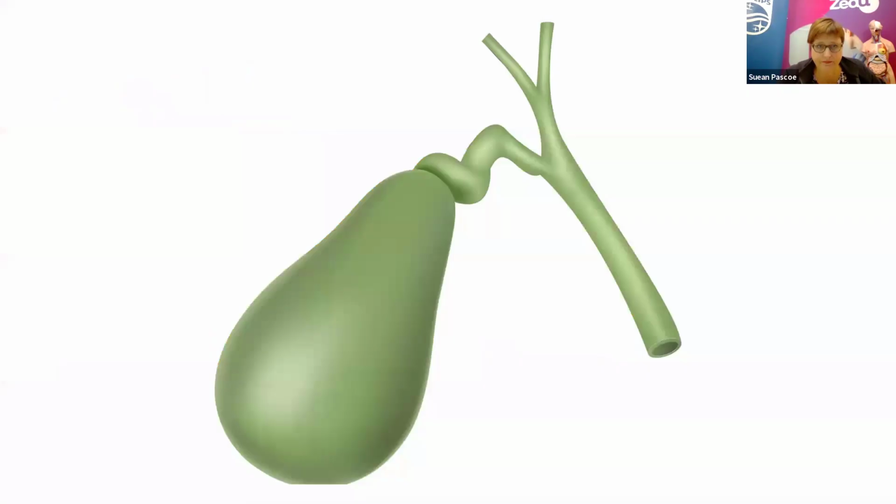The bile duct will increase with age, and our golden rule, what I learned way back in the dark ages, was for every decade of life add an extra millimeter after the age of 60. So a 70-year-old would have a 7 millimeter upper limit, a 90-year-old a 9 millimeter, but anything up to 10 millimeters is considered normal in the elderly. The common bile duct is formed where the common hepatic duct and the cystic duct join.